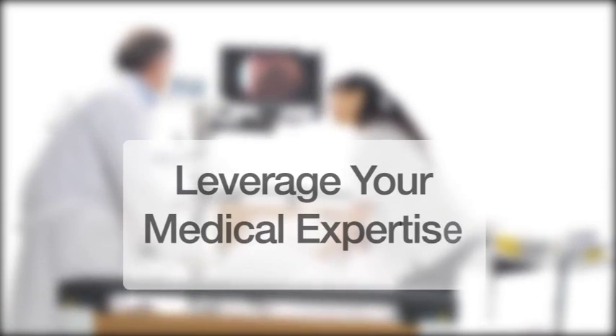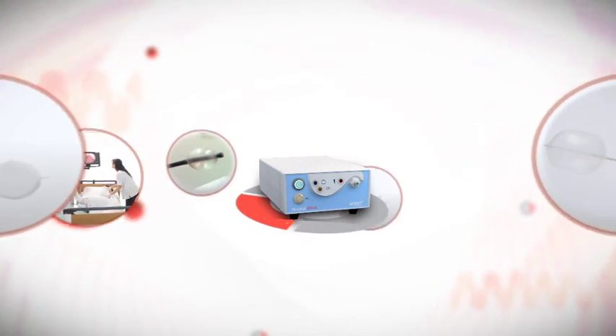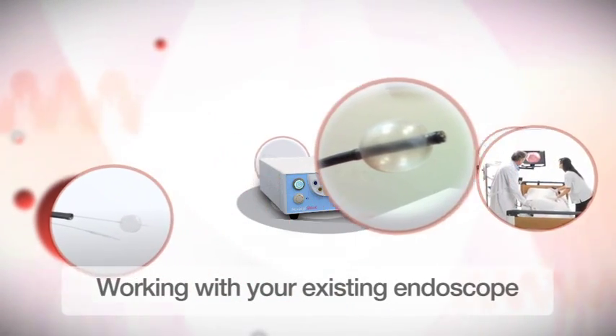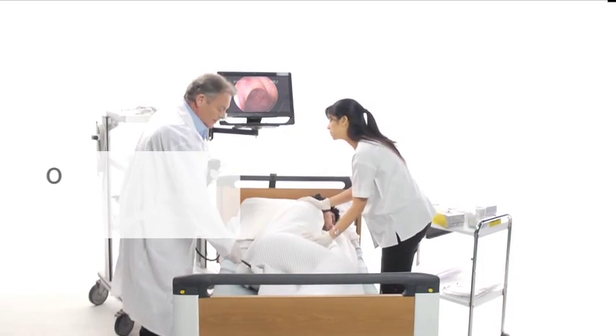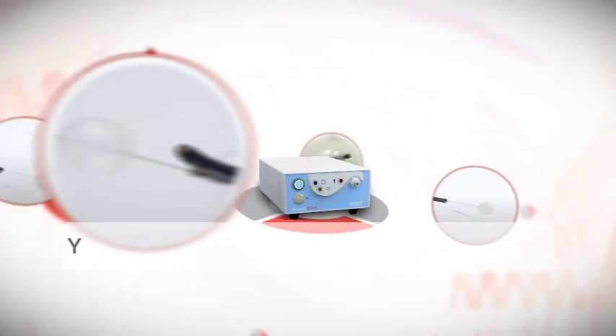Despite decades of evolution in GI endoscopy, several key challenges such as challenging colonoscopy, upper enteroscopy, and deep ileoscopy are issues that were yet to be resolved. Smart's Naviaid platform addresses these key issues by a series of single-use balloon devices working with your existing scope. All Naviaid devices are supported by a common inflation technology. They are used on demand through the channel and require no pre-mounting. With the Naviaid, your GI endoscope can accomplish so much more.